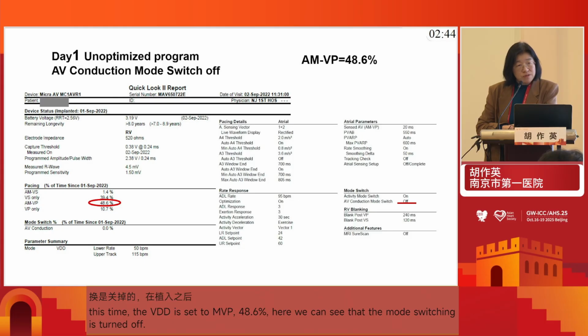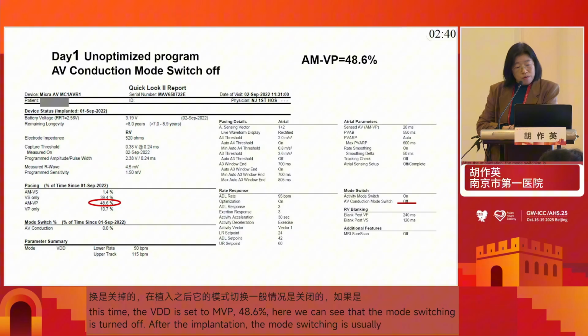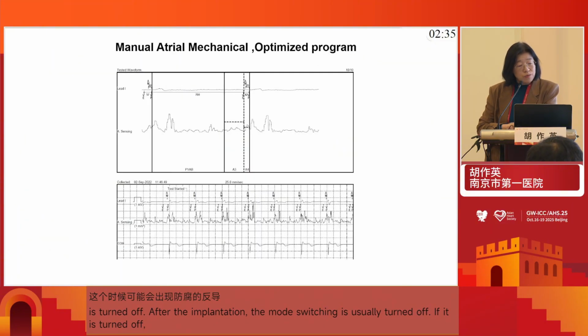If it's off, there will be AV conduction.